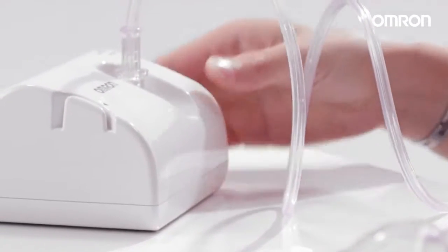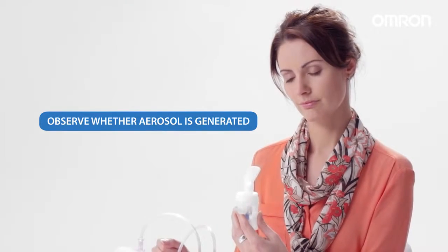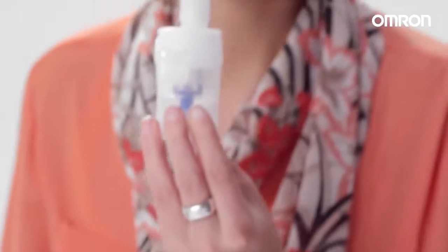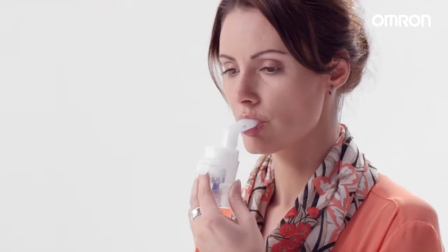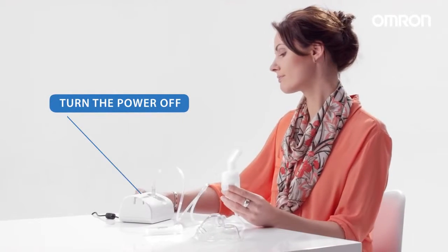Press the power switch and the nebulization process starts. Observe whether aerosol is generated. Insert the mouthpiece into your mouth and inhale the medication, breathing normally. Exhale as normal through the mouthpiece. Turn the power off after treatment.